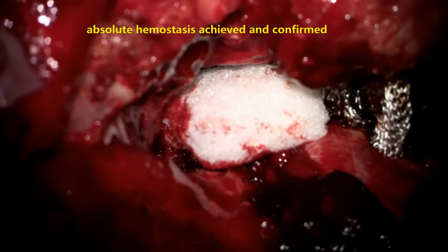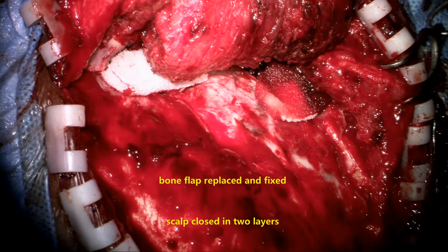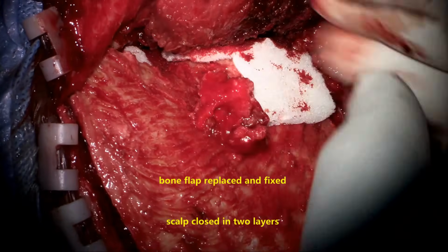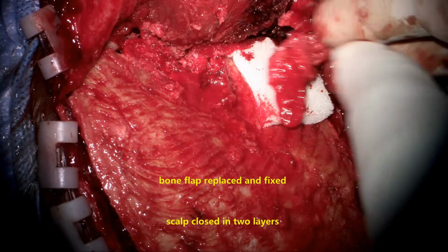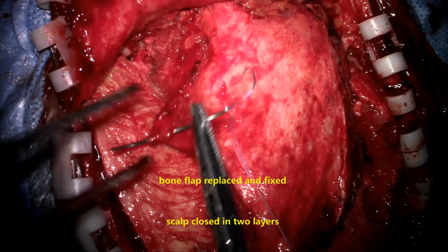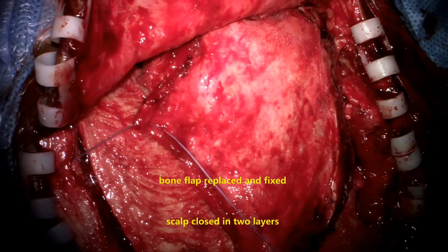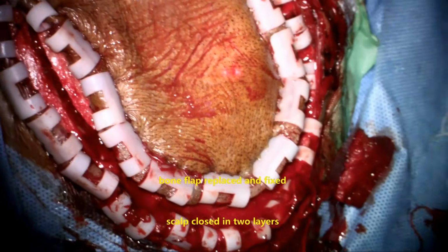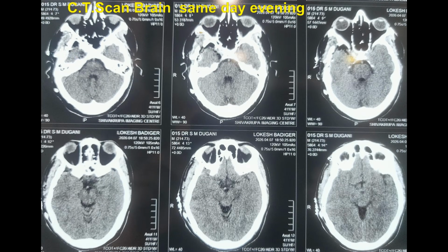The bone flap is replaced, the brain is lax, the dura is not opened at all, only a very basal anterior part about 1 inch, and that too when it was stuck with the tumor capsule. Bone is replaced and fixed, the temporalis muscle is closed with the galeal sutures all around and fixed, and the scalp is closed in 2 layers.